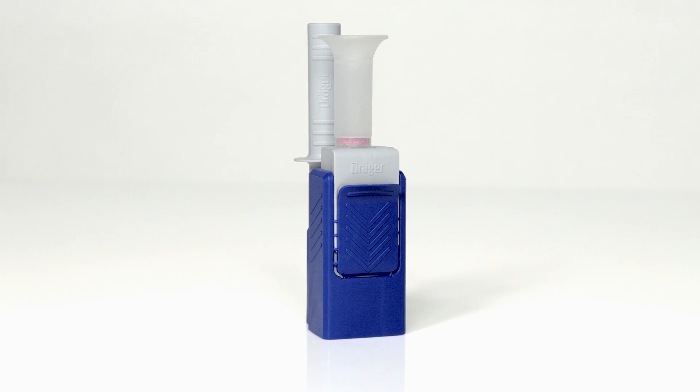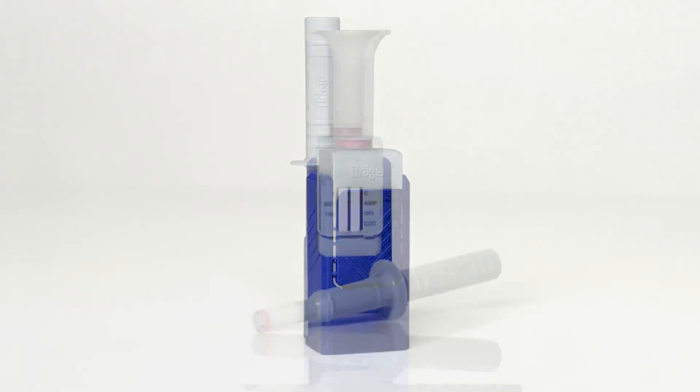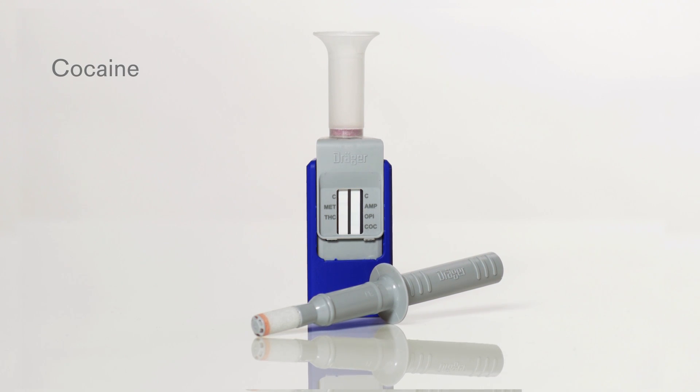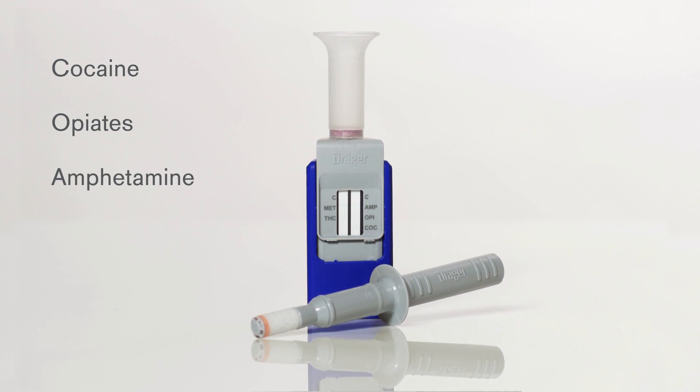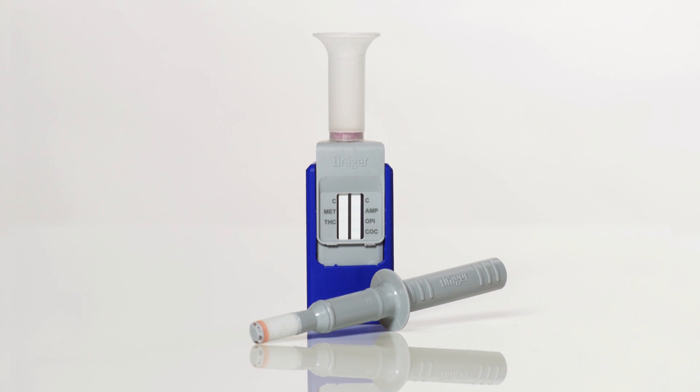Today we're presenting the Draeger DrugCheck 3000, our new, compact and saliva-based rapid drug test. We'd like to familiarize you with the testing procedure. With the single-use test kit, you can test a person for the five most common substance classes at the same time: cocaine, opiates, amphetamine, methamphetamine, and cannabis. You can prove the presence of these substances on the spot and within a very short space of time.